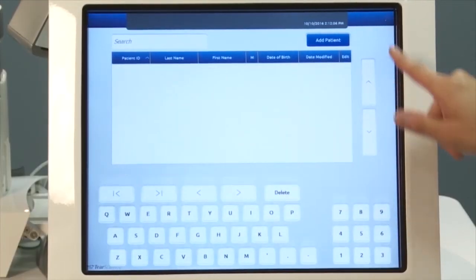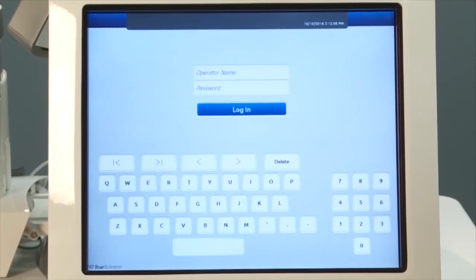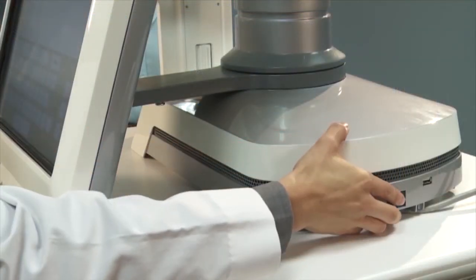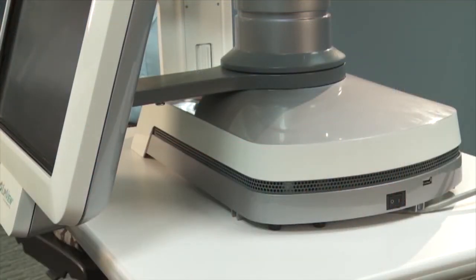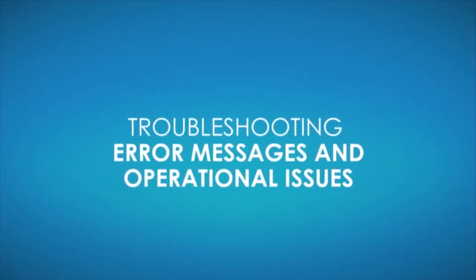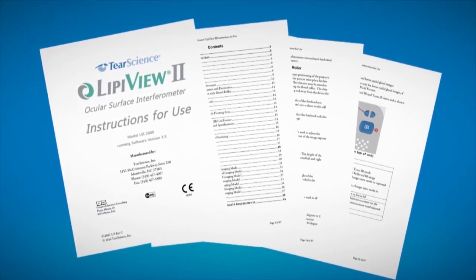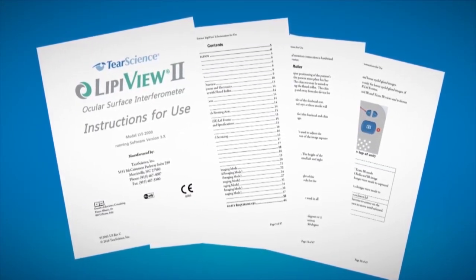Make sure to log out when the device is not in use. Power off LipiView 2 overnight to allow the device to cool down. The device does not need to be powered off between patient examinations during the day. A complete troubleshooting guide and all operational system messages are detailed in the LipiView 2 instructions for use.